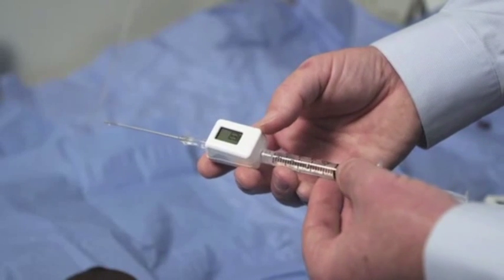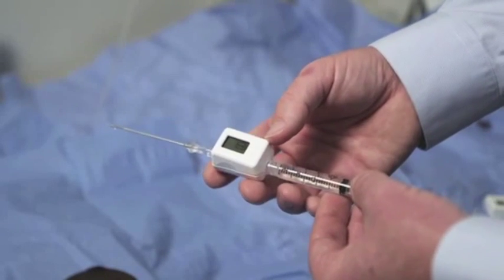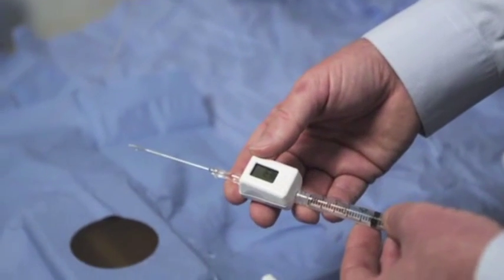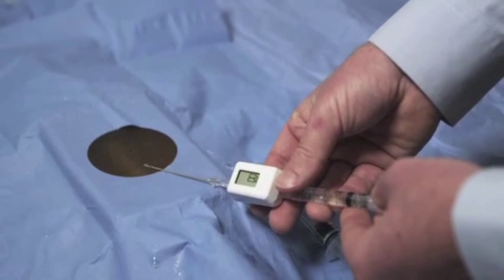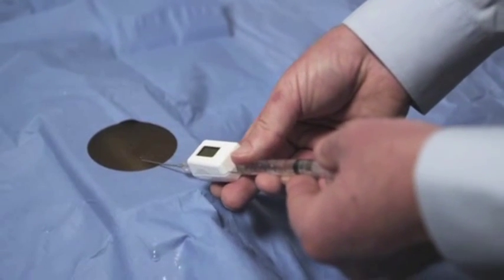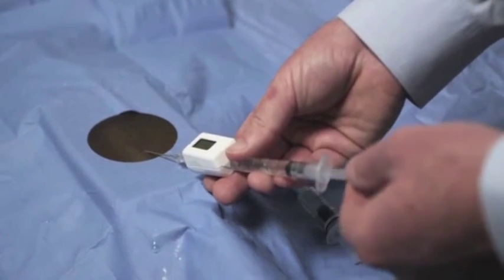The device is now ready for measuring compartment pressure. Proceed to the prepared limb and insert the needle into the tissue until the compartment is reached.